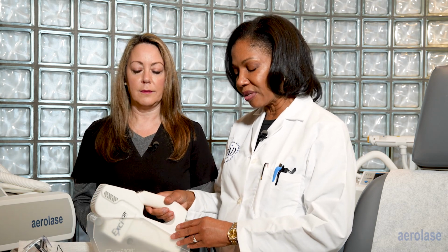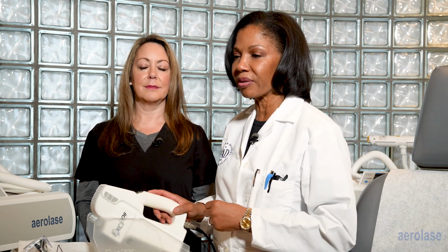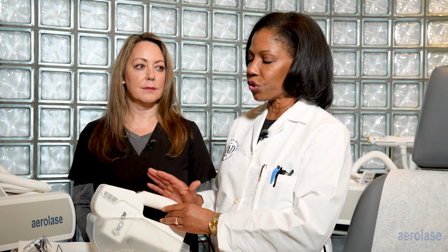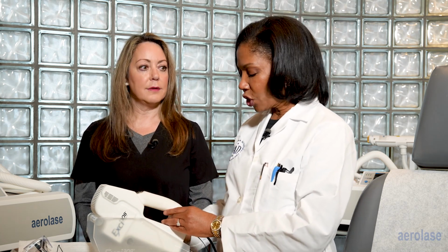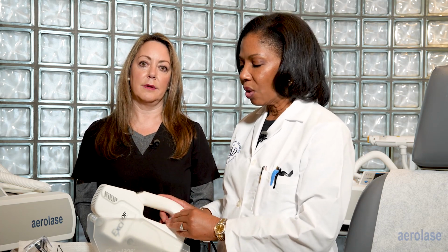As far as vitiligo, generally the treatment for psoriasis and eczema, sometimes they want you to go through a full treatment of different prescription medications, and this is like the last thing, or we have to get a pre-authorization in order to use this. And some of the codes that we have used is 96910 for reimbursement for narrowband UVB light.